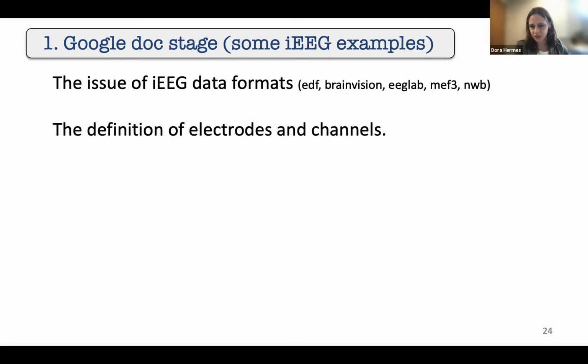And so we have two distinct structures. One is for the hardware contacts, which is called electrodes. Every contact that makes contact with the surface of the brain is an electrode, and every channel is a signal in your amplifier. Now, at the time when this definition had been quite established, we asked some more neurosurgeons to review this, and they said, actually, we call an entire probe for stereo EEG, with about 8 channels on it, an electrode. So one electrode is what we call a probe, and we call every single contact a contact.